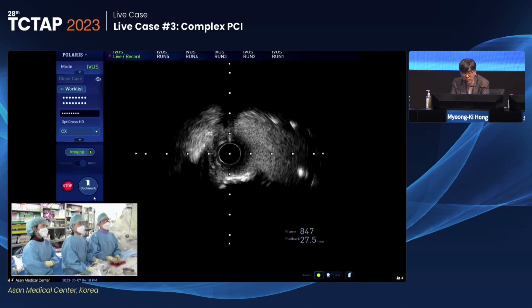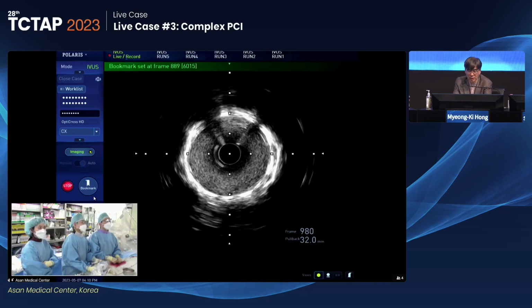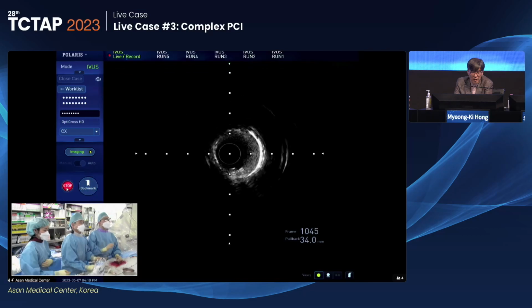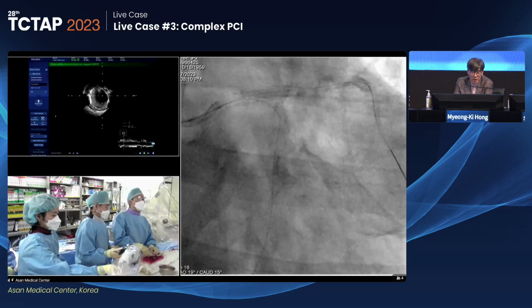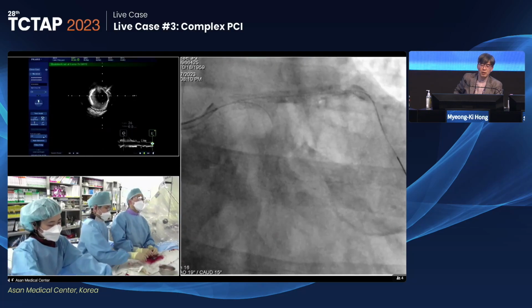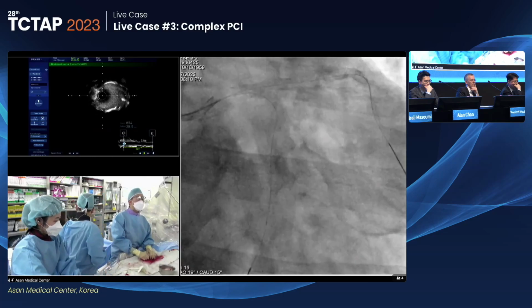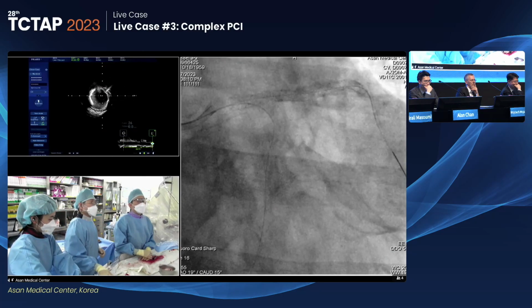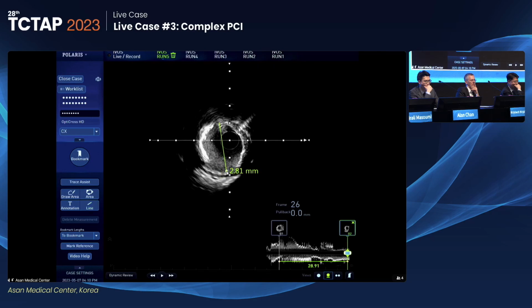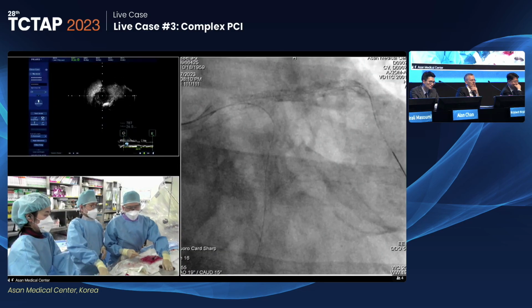This is a left main. So could you bring the wire to the high lateral branch, and then if you can show us the pullback IVUS from the high obtuse marginal? Yeah, upper side branch. But I think it would be something dangerous. I will not try. It will not affect the patient outcome.